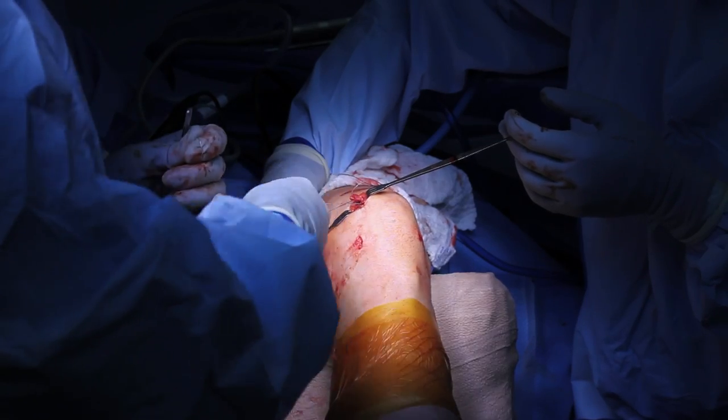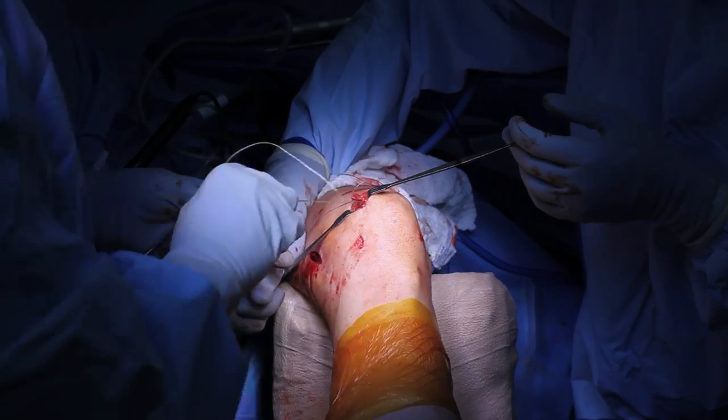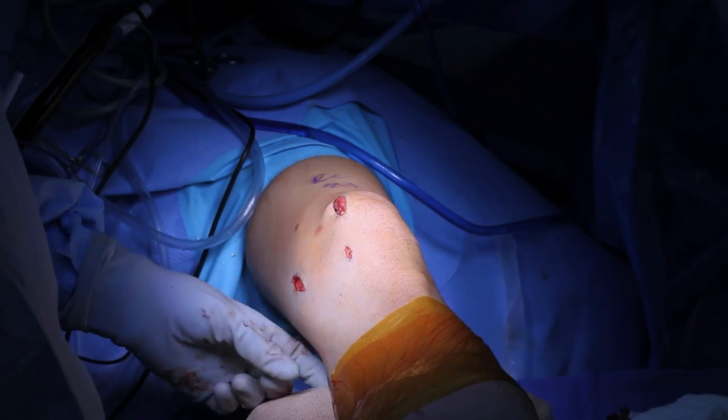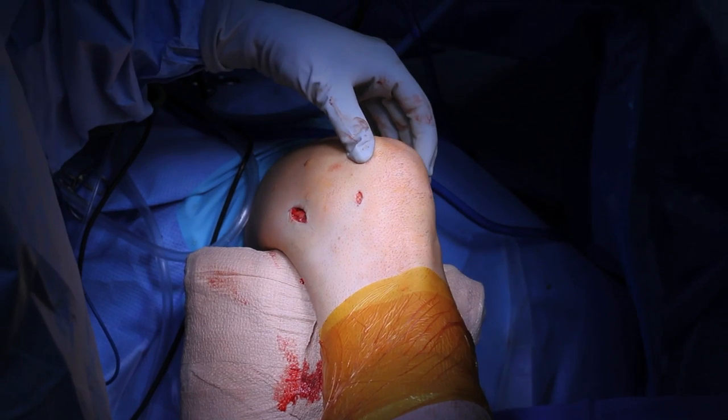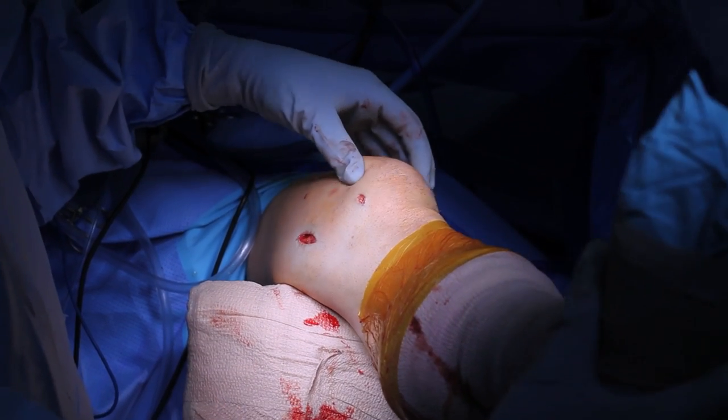It's critical in this case not to over-constrain the kneecap. The medial patellofemoral ligament acts more as a check rein to simply prevent the kneecap from translating laterally and dislocating. It's not there to hold the kneecap in place.